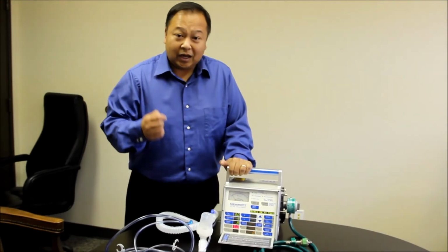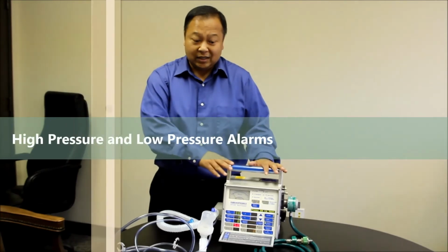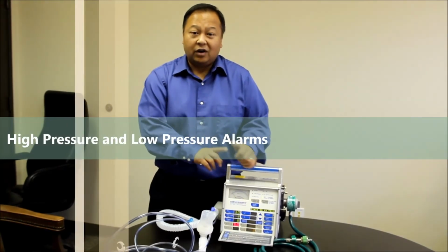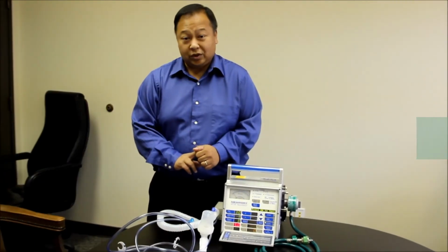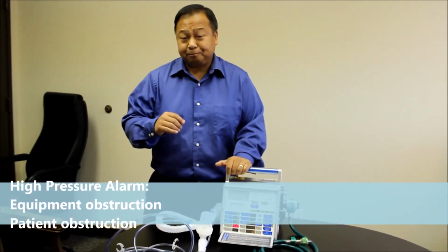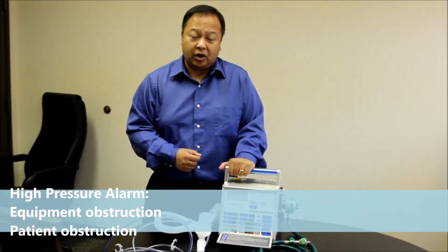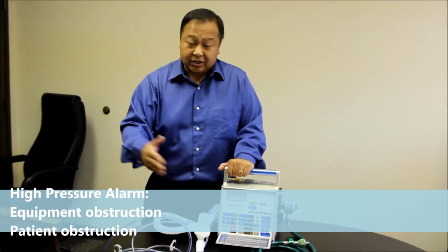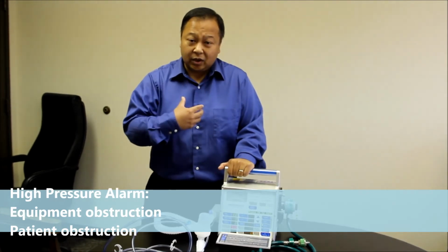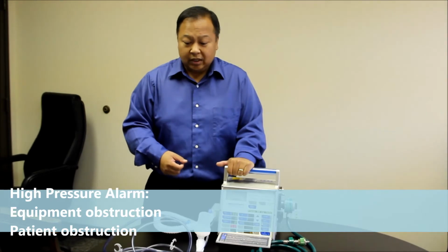I explain to them that the two most common alarms we face when the ventilators go off are high pressure alarms and low pressure alarms. When we're talking about high pressure alarms, a few things cause this. A patient coughing will trigger the high pressure alarm. Secretions that patients have developed in their airways, which are an obstruction, will cause high pressure alarms.